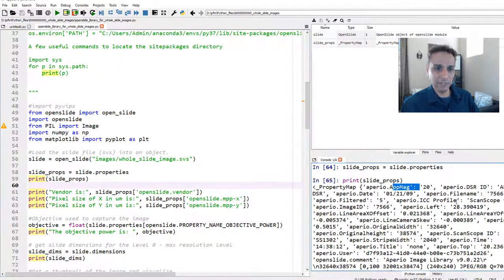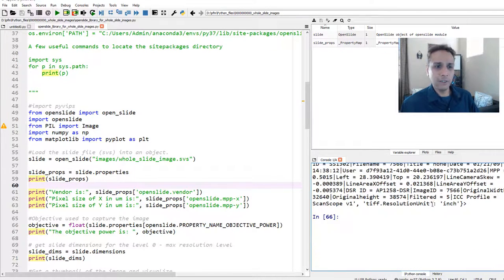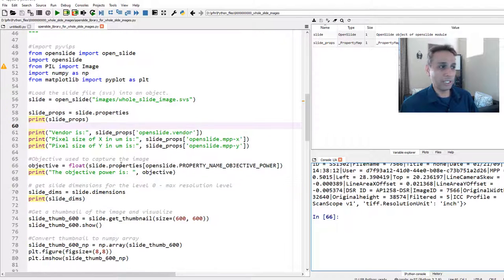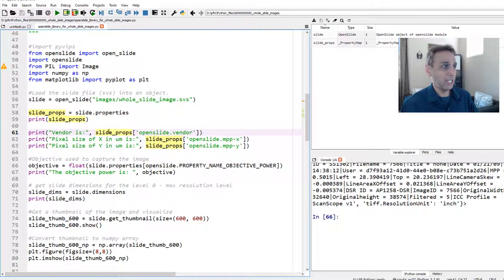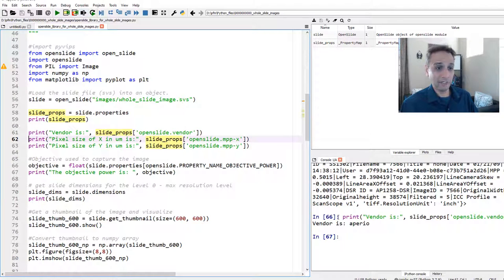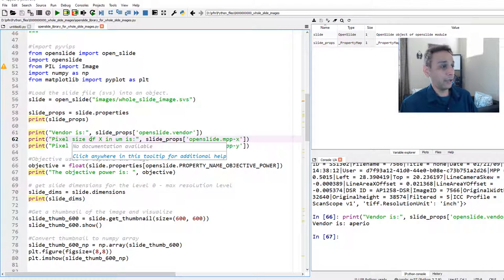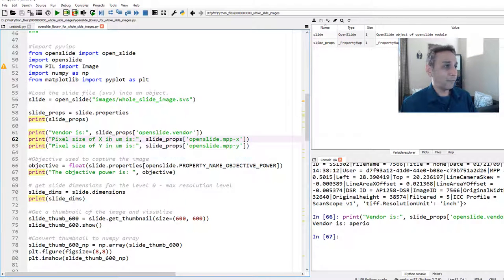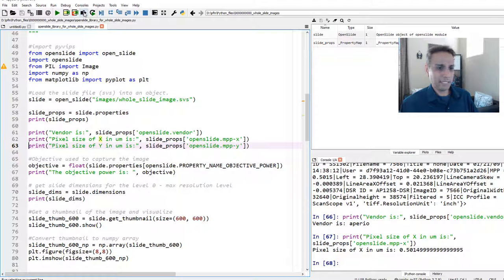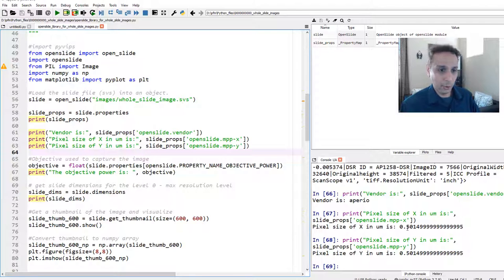Printing the properties shows a lot of information — magnification, ID, and much more. If you want a specific property, like the vendor, check slide.properties[openslide.PROPERTY_NAME_VENDOR] — it's Aperio since this is an SVS file. For pixel size, the X pixel size is 0.5 microns (500 nanometers), and Y is the same — an isometric pixel from an optical microscope.